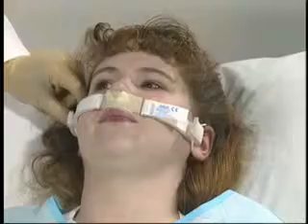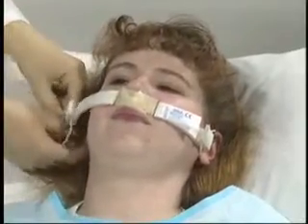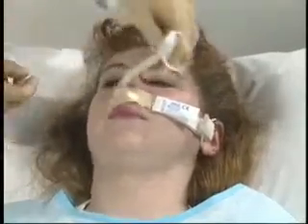To change the dressing, simply remove one ear loop, change the dressing, and replace the loop around the ear.